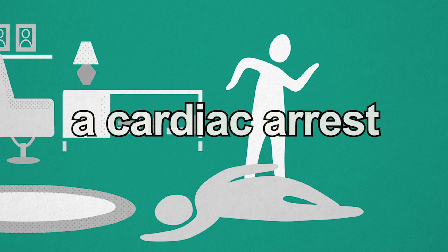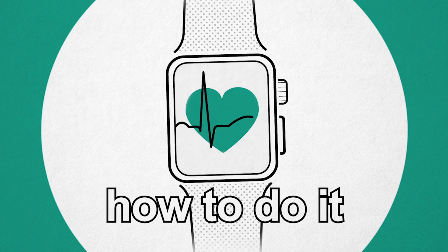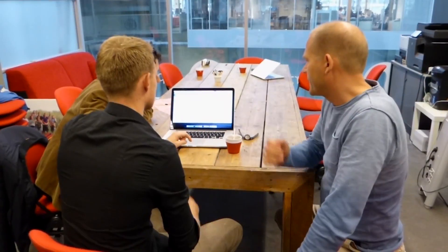Imagine, in case of a cardiac arrest, that you instantly would know what to do and how to do it. With the SAM CPR app on the Apple Watch, everyone can do effective chest compression without any training.